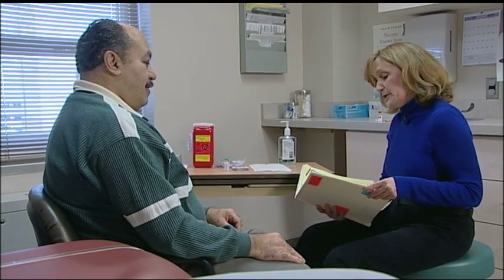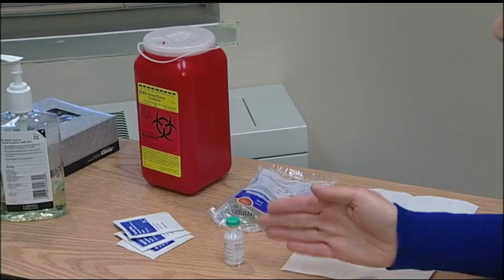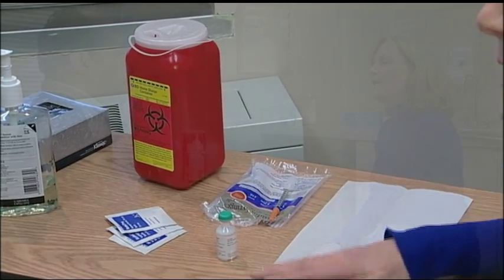I see your doctor ordered you to take some insulin. Yes, he did. You'll be taking 10 units of long-acting insulin each night before bed. And I see you've brought all your supplies with you. Let's go over them together: your insulin, your syringes, alcohol swabs, and a sharps container.